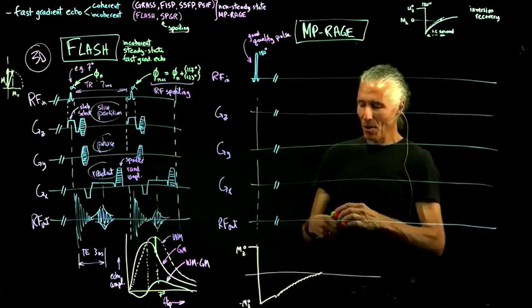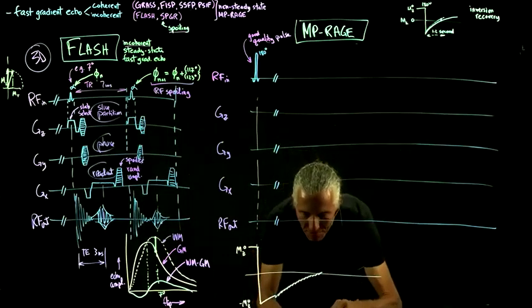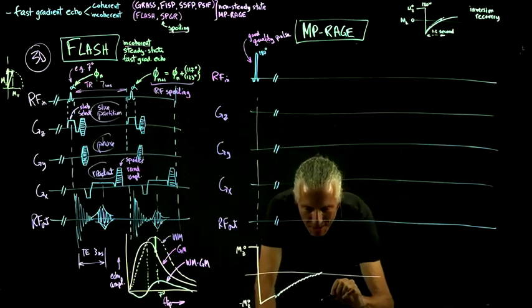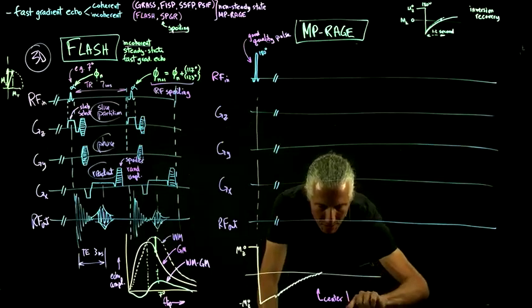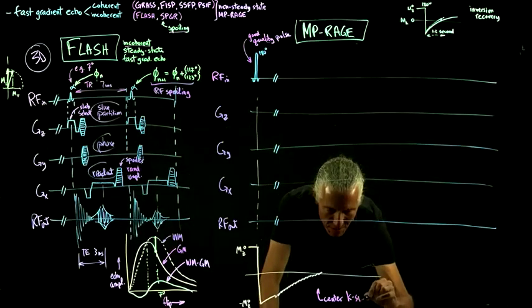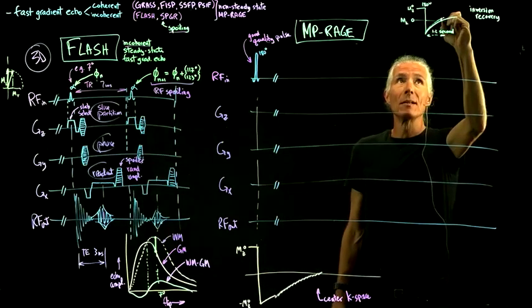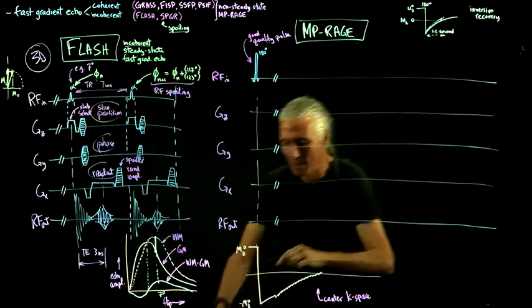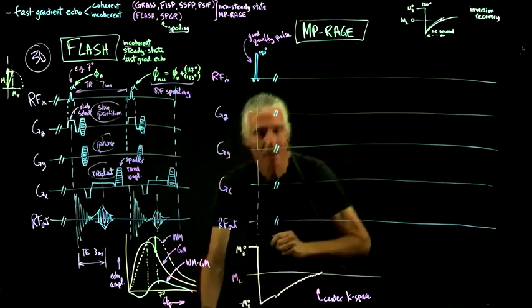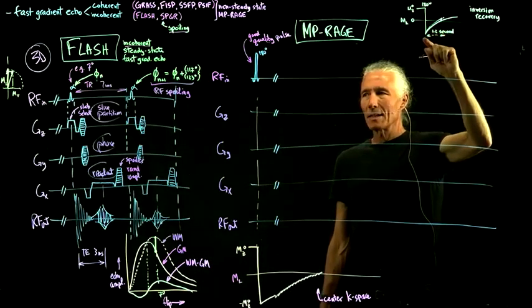And then the hope is, right at the center of K-space, because as you'll see in the homework, the center of K-space is very important for determining the contrast. So you wait until you're hoping that the white matter got slightly above, this is longitudinal magnetization, slightly above 0, so that there's a signal, but the gray matter got exactly at 0.